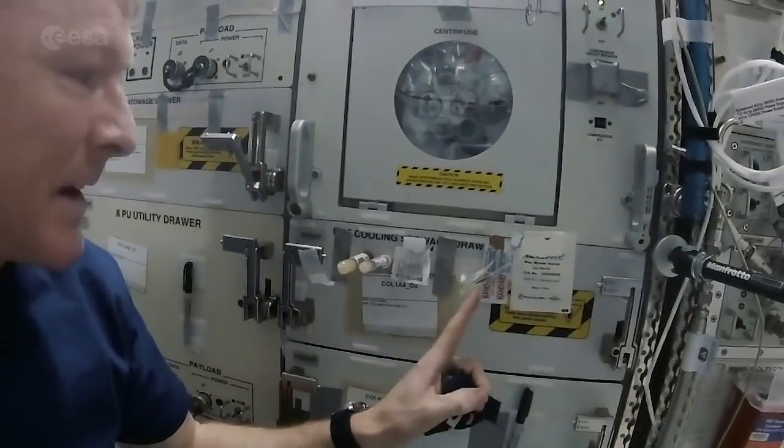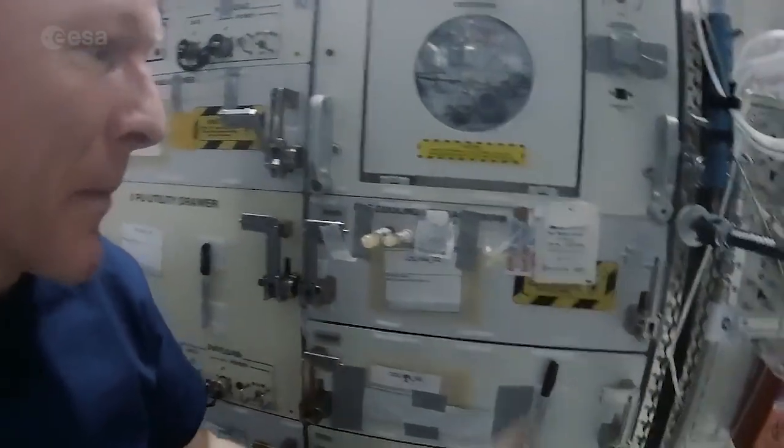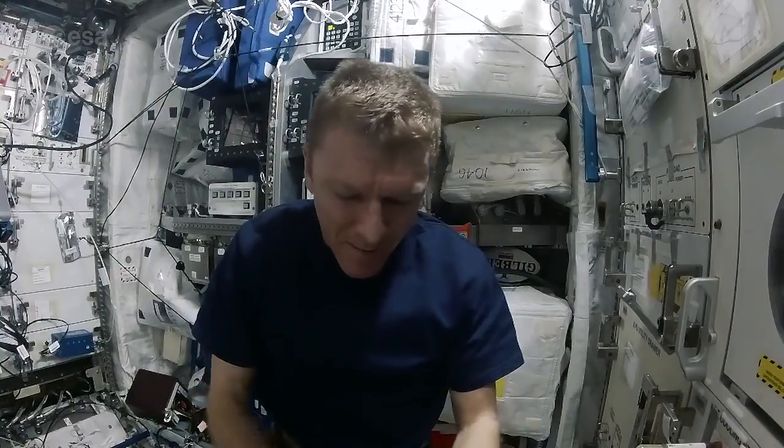I've got a butterfly needle and then two blood tubes — not too much this morning — followed by some gauze and a band-aid. And I mustn't forget my tourniquet. With everything ready to go, I just need to stick myself, so I'll get the tourniquet ready first and get that on my arm.